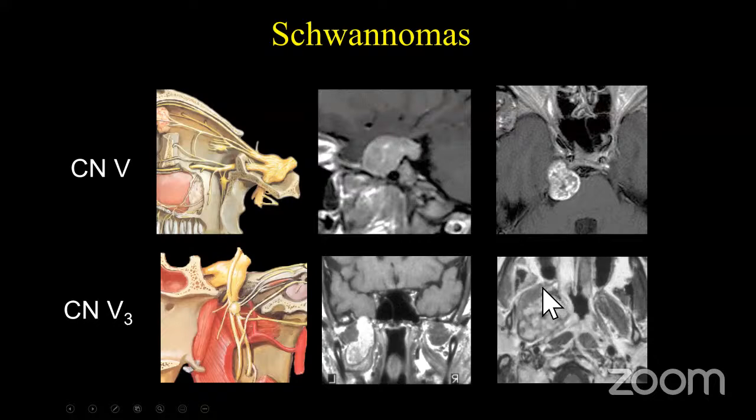Now, this image on the right identifies exactly where this is arising from. And part of it is that we as radiologists don't have the capability to operate on someone as neurosurgeons do, but what we do have is the ability to look at the anatomy. And as Naren suggested, the anatomy is so key. So in this case, we can see this mass right here that's involved in the masticator space, but to take it to the next level, you have to understand that anatomy.